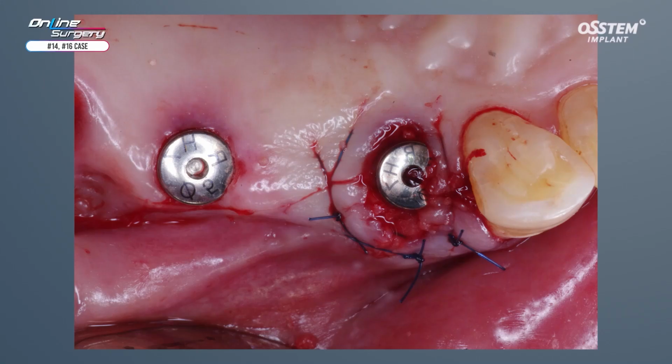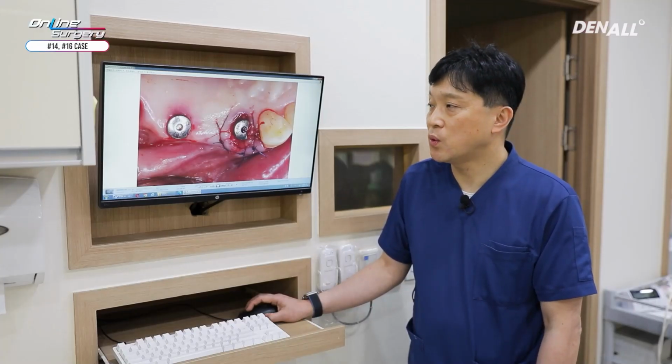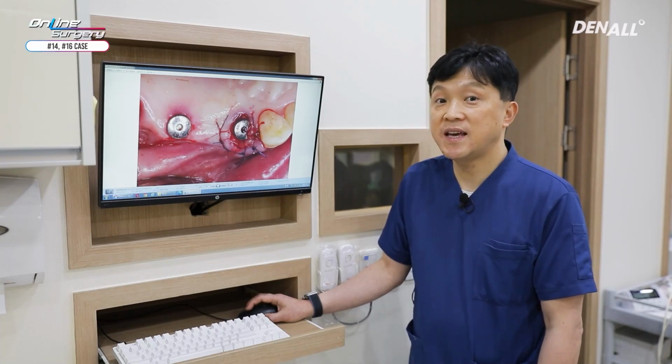In the case of number 14, a GBR was done. Multiple sutures were used for adaptation. Yes, you can proceed with surgery without a guide. That is possible.